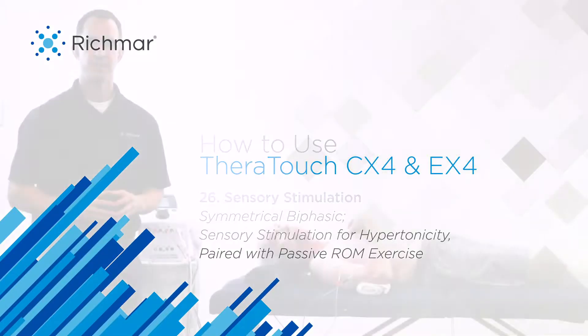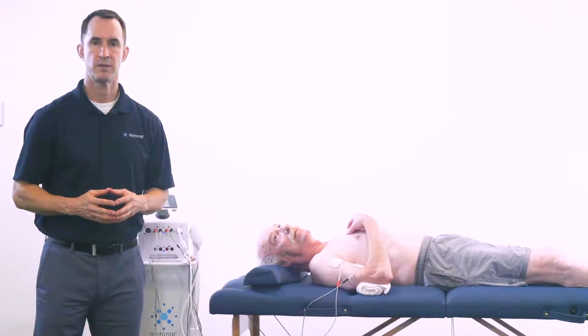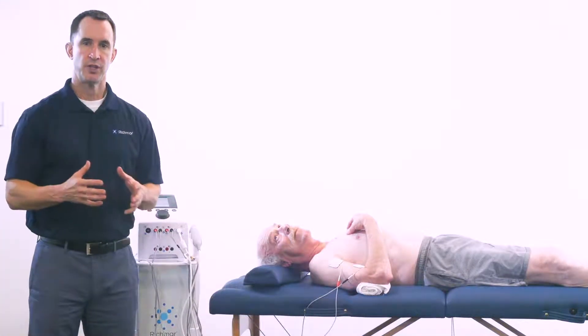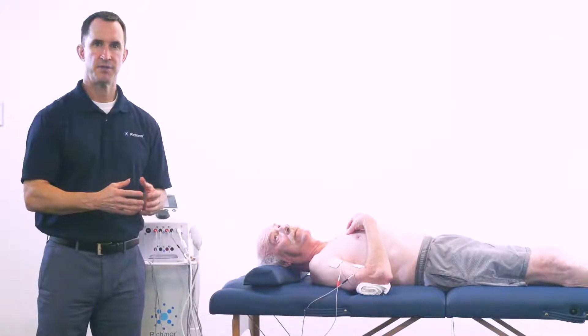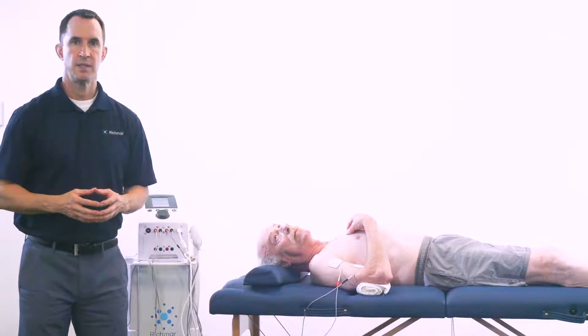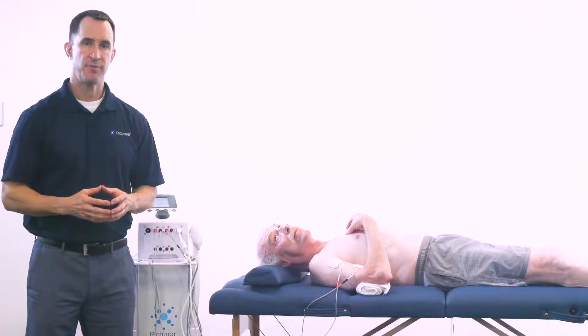Treatment of hypertonicity using sensory stimulation in your TheraTouch EX4 or CX4 combo unit. In this approach we're going to use a symmetrical biphasic waveform. The treatment approach is to provide a sensory level stimulation to help reduce hypertonicity of the biceps. The mechanism of action is a gating mechanism at the dorsal horn of the spinal cord.